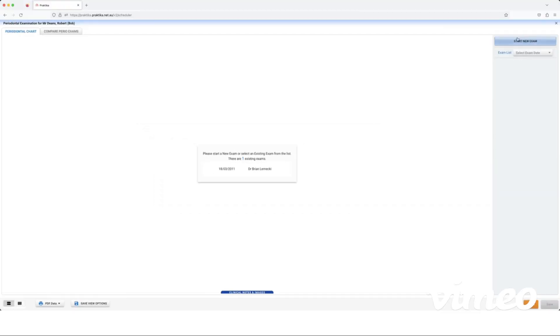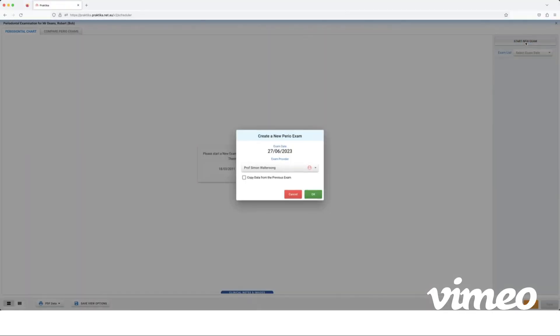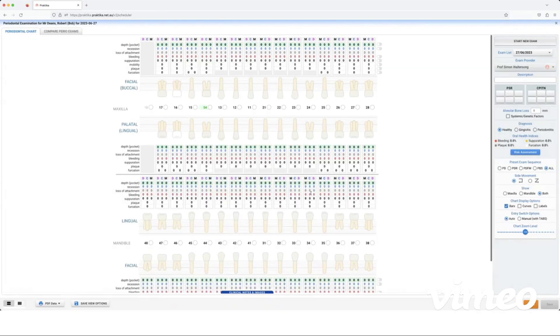Otherwise I can start a new exam from the top right. We're going to start a new exam. I have the option to copy data from the previous exam if I want to, otherwise I can just start a completely blank chart which I'm going to do. Before we start charting we have a few view options that we can change here.